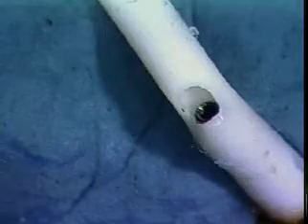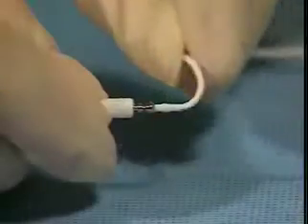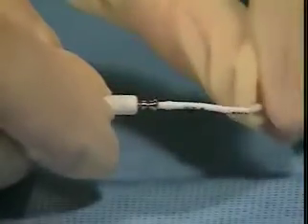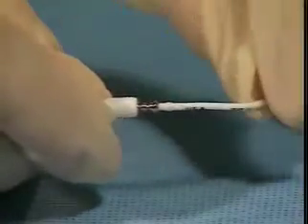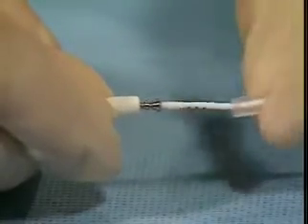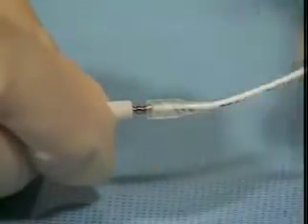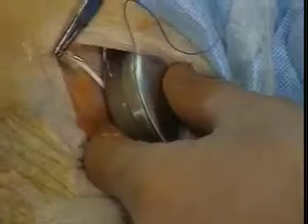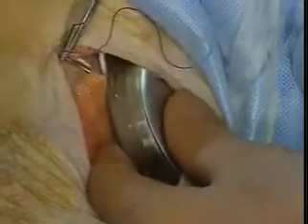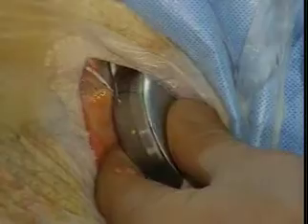Punctures in the catheter may occur if a strain relief sleeve is not used at the catheter or pump connection site. Repetitive motion can cause the catheter connecting pins to puncture the catheter if it is not protected. To avoid these types of punctures, always use the appropriate strain relief sleeves packaged with the catheter. Use caution when handling sharp surgical instruments such as suture needles, scalpels, and refill needles near the catheter.